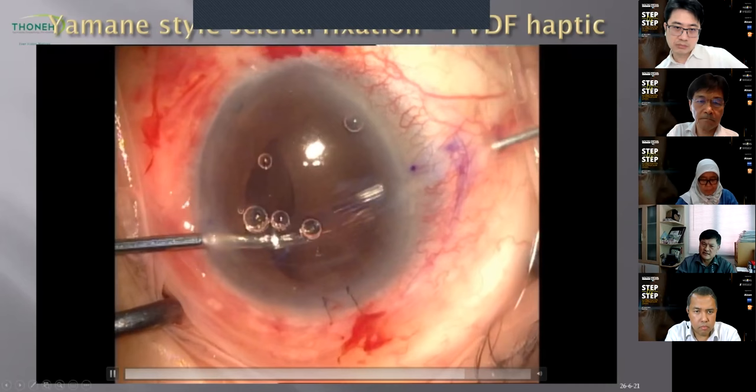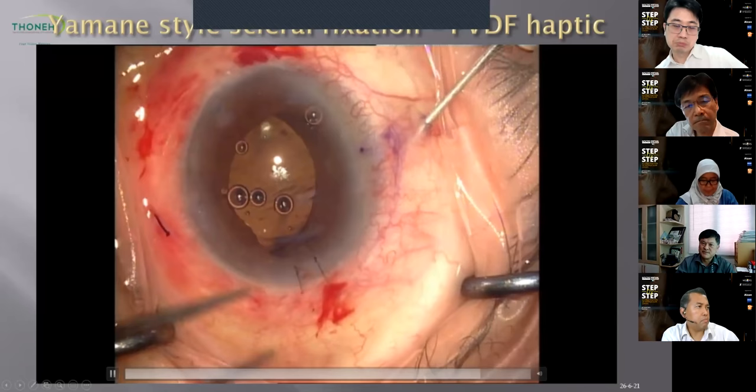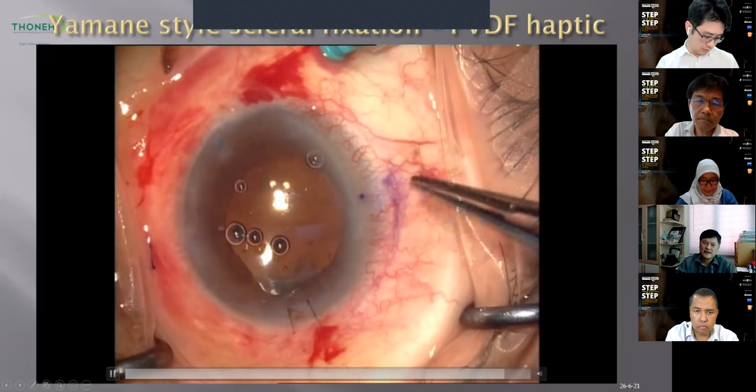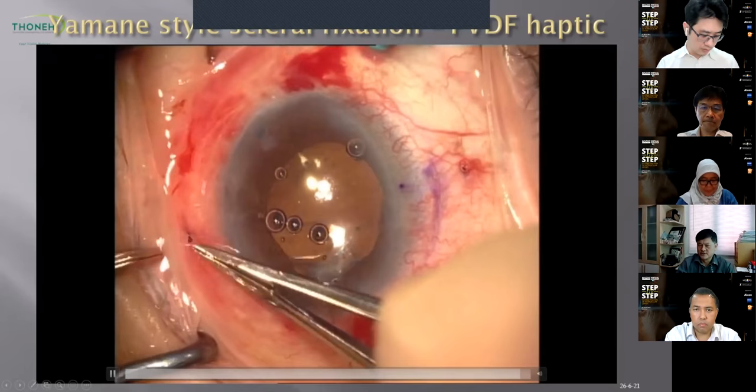the manipulation is not too much, but what you actually did not see is the distortion and deformation at the optic-haptic junction here. Okay, so if this is a PVDF haptic, likely there will be a distortion and lead to a lens tilt. So once the haptic is externalized, then it's cauterized to form a flange, and both ends are pushed down to the sclerotomy. And centration of the optic is then checked. And if it's well, then that will be the end of the procedure.